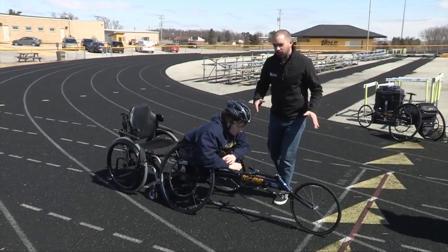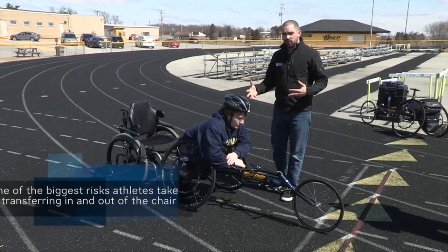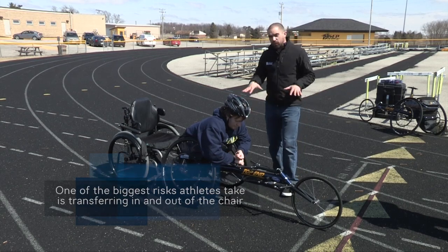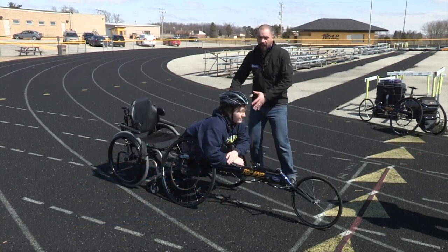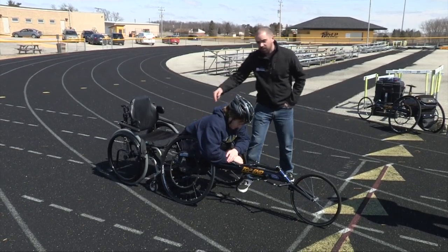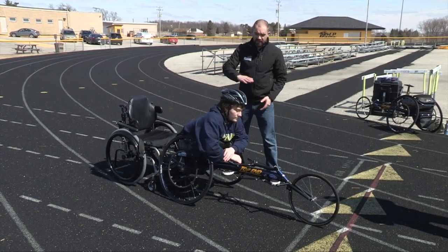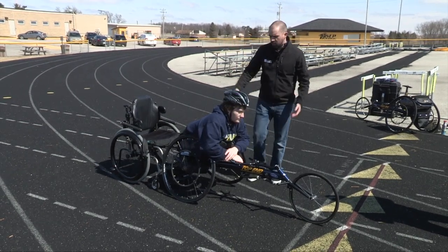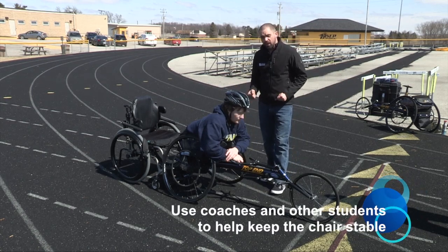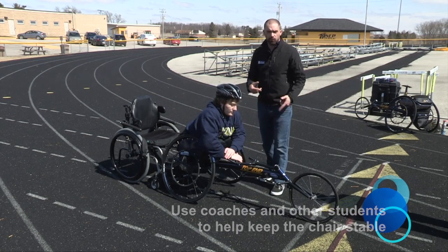In every aspect of racing wheelchairs, we want to make sure that the athlete is going to be able to stay safe. Unfortunately, one of the points where you can injure the athlete most commonly is actually transferring in and out of the chair. The way the chairs are designed, all their mass is in front of the center of gravity, which is the axle. If he sits upright, his mass will be behind that center of gravity, making it very easy for the chair to tip over, causing a head injury or other issues. So we want to make sure that when they're transferring in and out, especially the first few times, that they have a little bit of help from coaches or other student athletes to keep the chair stable.